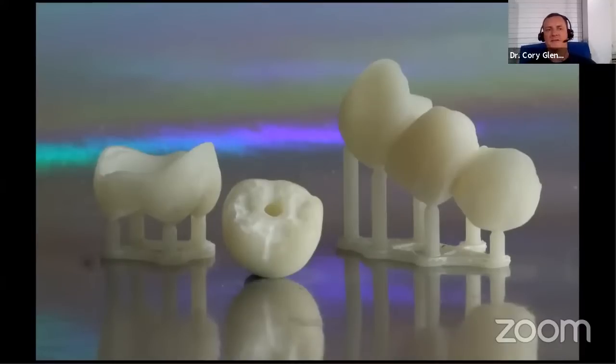Part of the instructions of this material is that after you print it, you're going to alcohol wash it, and then it actually has to be sandblasted because this is such a highly filled resin that when it washes away that little bit of oxygen inhibited layer of resin, it leaves exposed portions of the filler particle. And so you do have to sandblast that to get rid of it. Of course, that's going to only help your bond strength as well. And then you would just cure this, and then it's ready to go in the mouth.